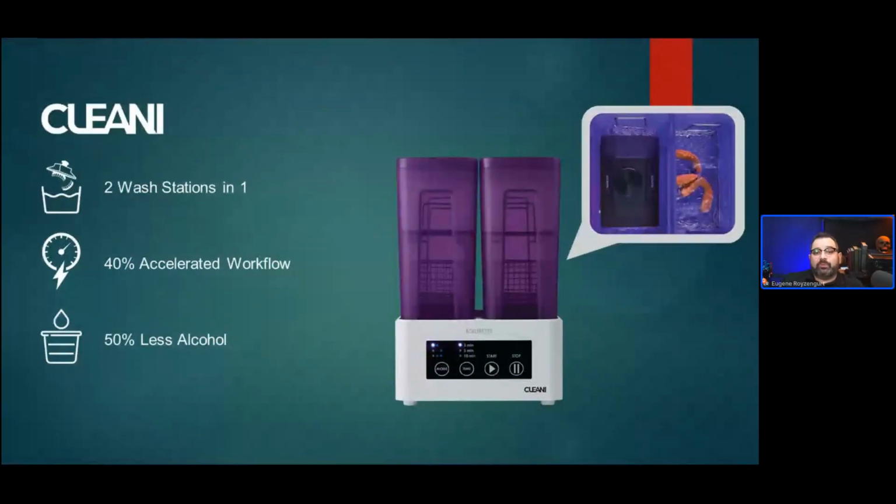Now, if you're using a different printer, you can still use this machine, but sometimes the build plates will be too large, so you'll have to remove the prints first. And then I'll go from here and put it in the second one.